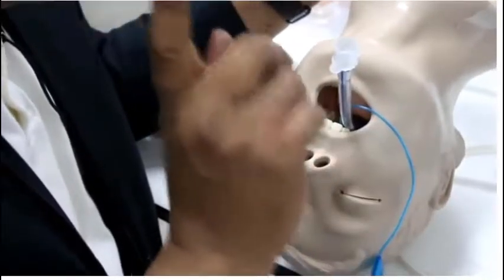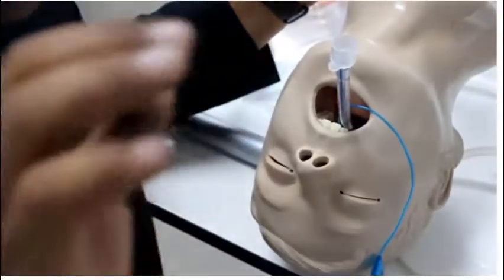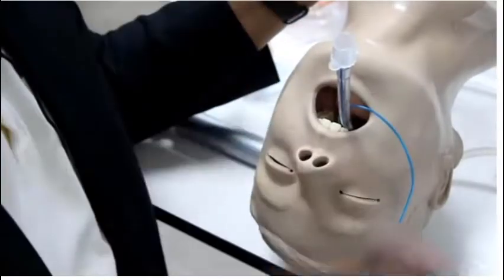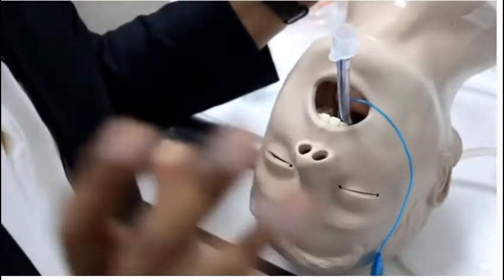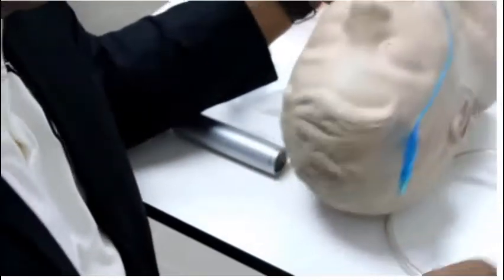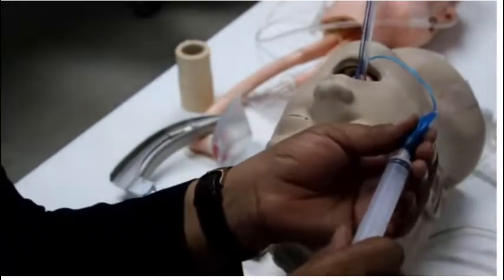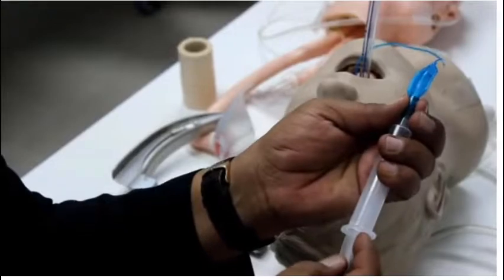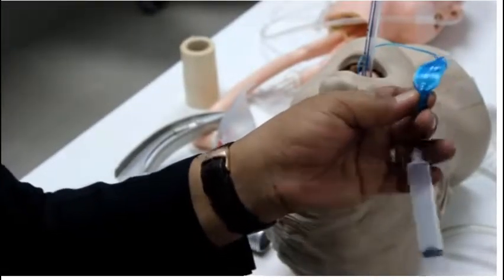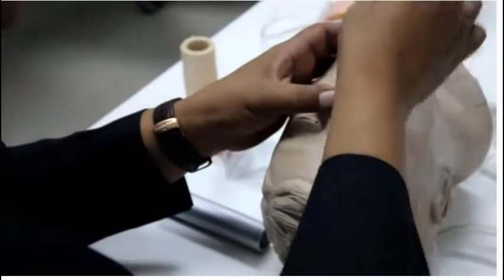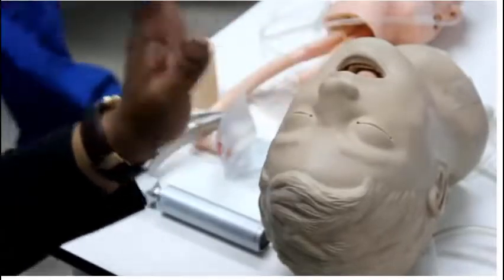Okay, you have the key words here. You have to insert the tube through the vocal cords under direct vision. When you finish this, you give the syringe, pull on the valve and deflate and take it out, simply like this.